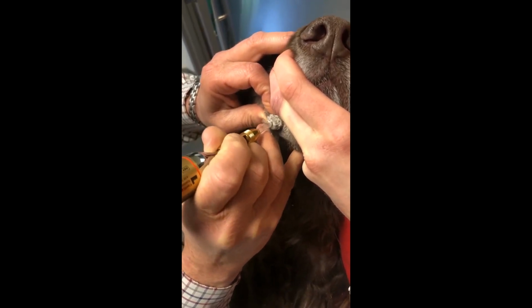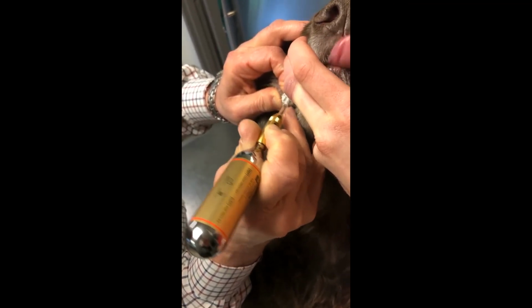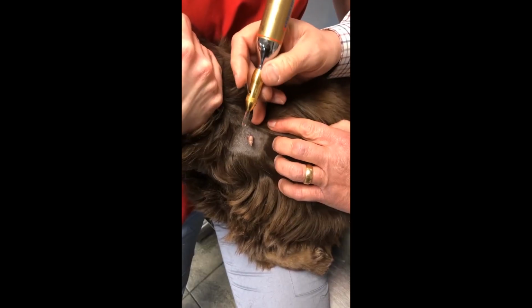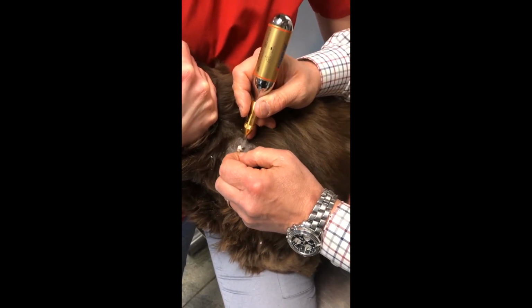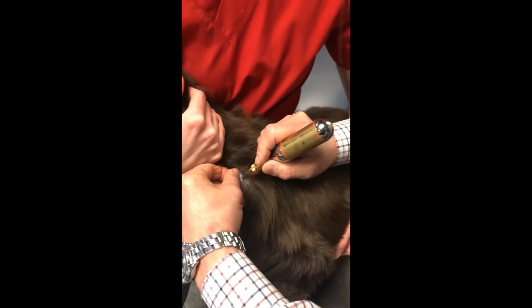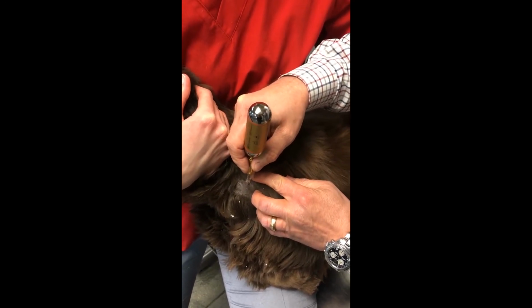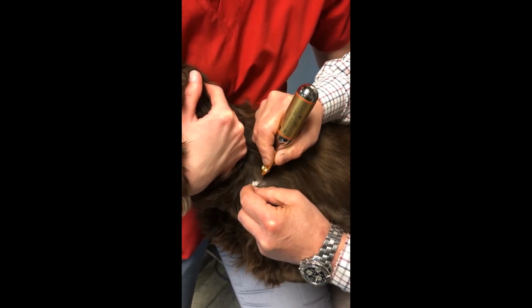Again, the lidocaine is not necessary, but in an area of the face, it definitely makes it less arduous to get the mass frozen. Go back to the other one. So this is the mass post-thaw cycle, and we're going to start again at the base, freezing as we go. Knocking off any accumulation of frost so that the mass has as quick a freeze cycle as possible.